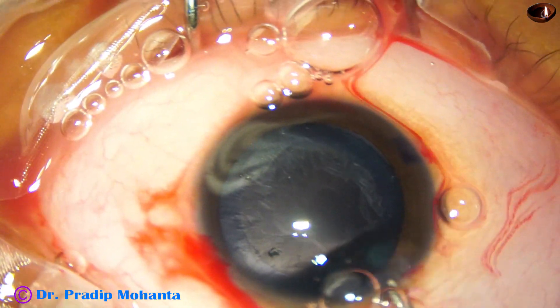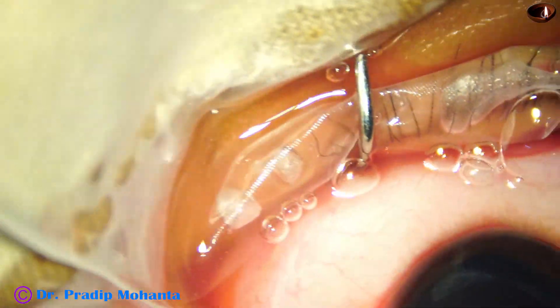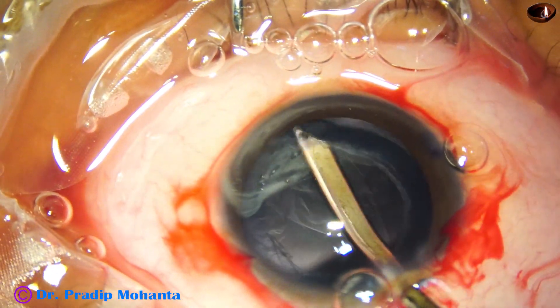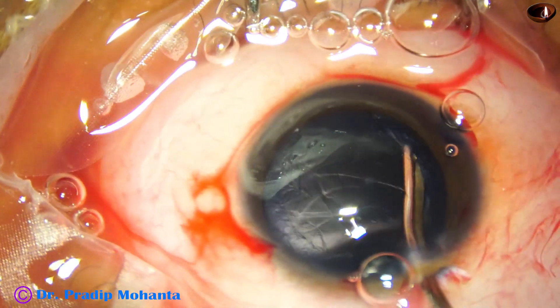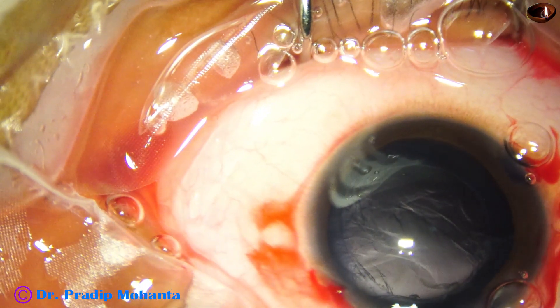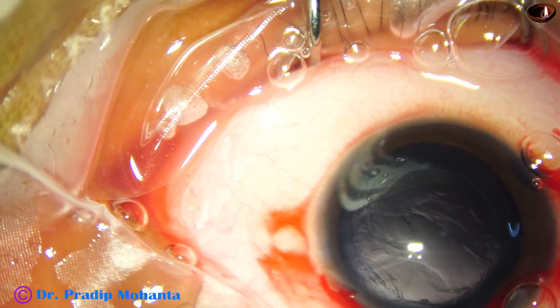Now OVD is injected into the capsular bag and the anterior chamber. The patient is under general anesthesia, but the patient is moving his head occasionally.